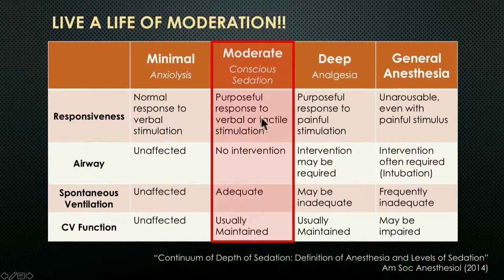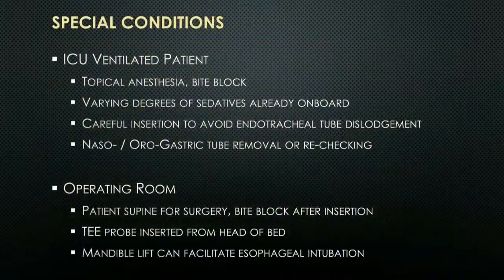The patient should have a purposeful response to verbal and light tactile stimulation. The airway is going to be affected but should not require intervention in terms of oral airways or potential intubation. Spontaneous ventilation should be adequate. And if you get any deeper than that, you've gone into undetermined territory and dangerous for the patient. So moderate sedation is the goal, and you should know these criteria for what classifies as moderate sedation.